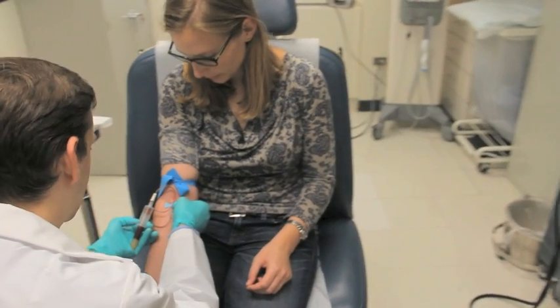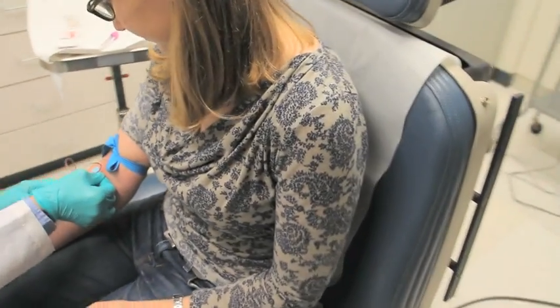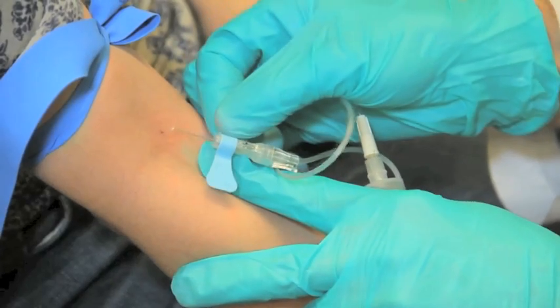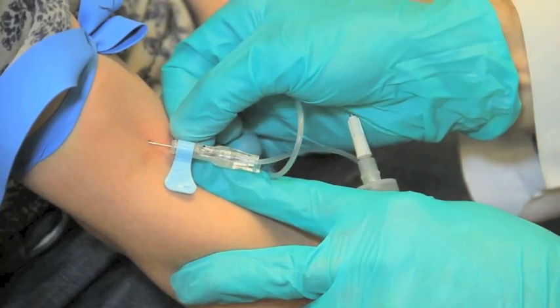A patient who intently looks at the needle entering the vein is more likely to faint. If you are concerned that this might be the case with your patient, you can politely request that he or she looks away while the needle is inserted. When you see a flash of blood, your needle is in the vein. Once you see the flash, maintain constant pressure on the patient's forearm with your right, second, and third finger.